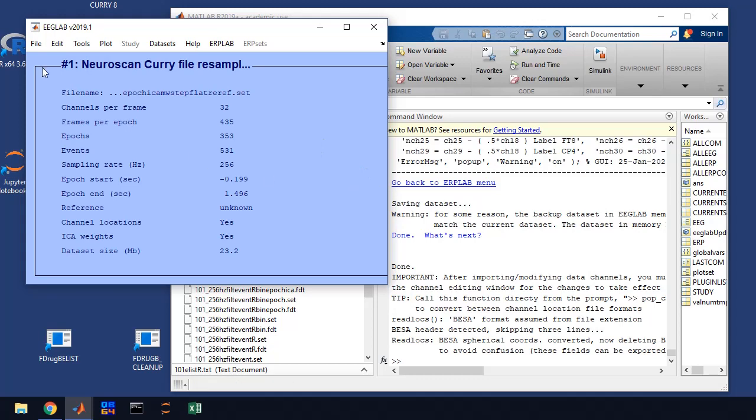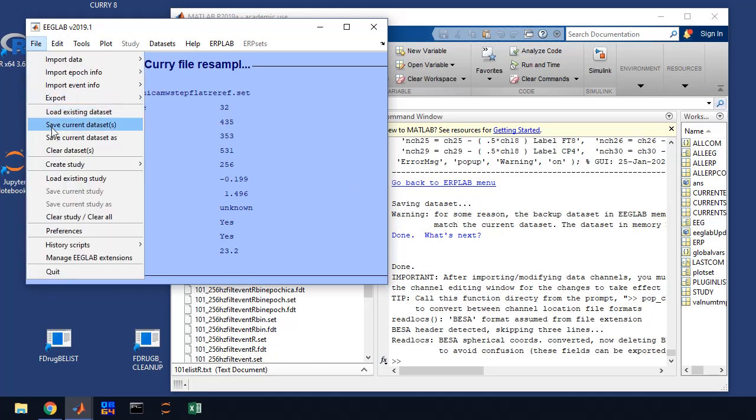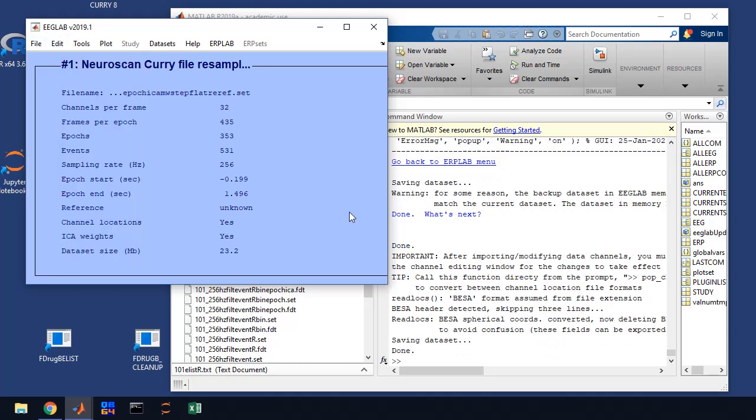You want to save it, so go ahead and save the current data set, because if you don't, if we went back to that data file, it would lose the channel locations. So now we're ready to average ERPs.